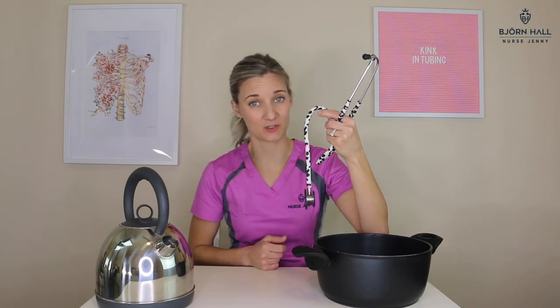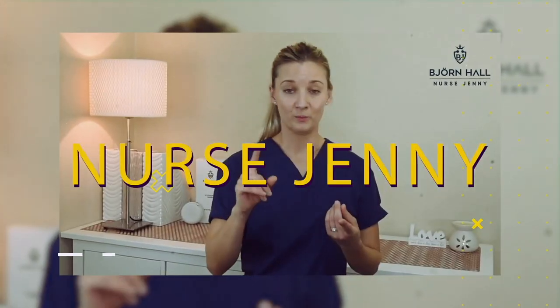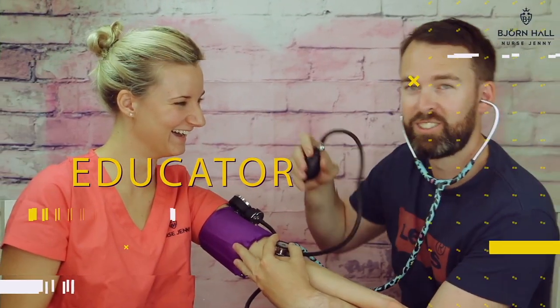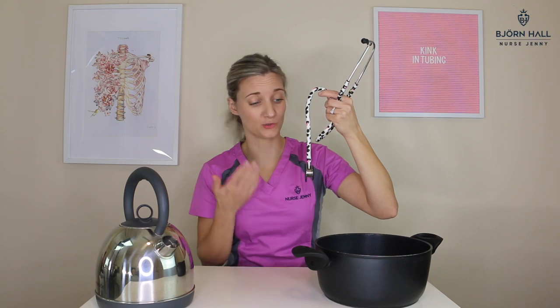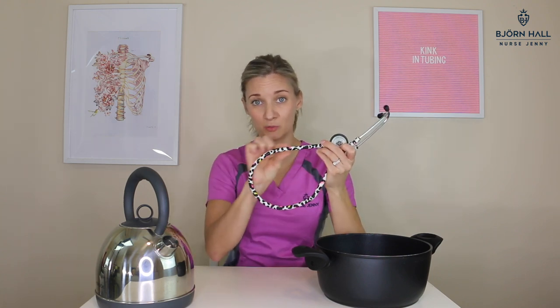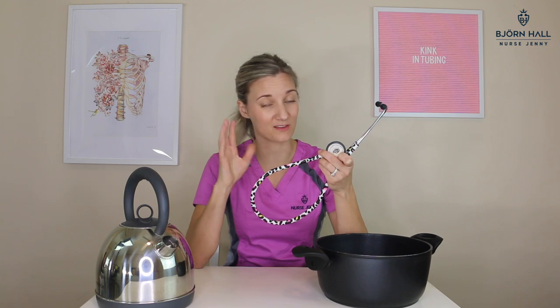Have you got a kink in your stethoscope tubing? Stay tuned because I'm going to show you how you can get rid of it. If you've had your stethoscope wrapped up in your pocket, in your bag, or left in a car overnight in freezing temperatures, you may notice a kink in your tubing that just won't go away. I'm going to show you a super easy way to get rid of it in three easy steps.